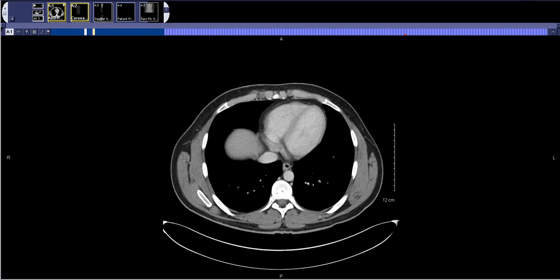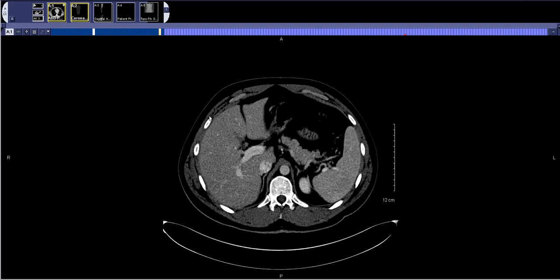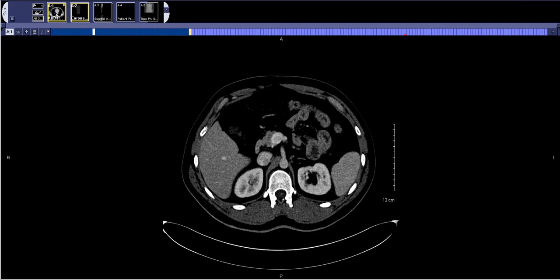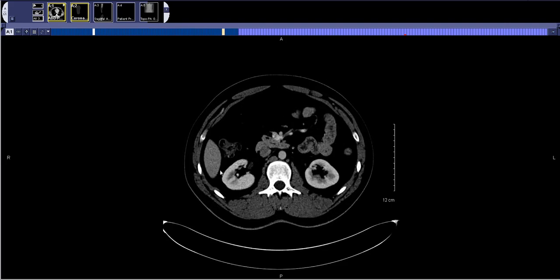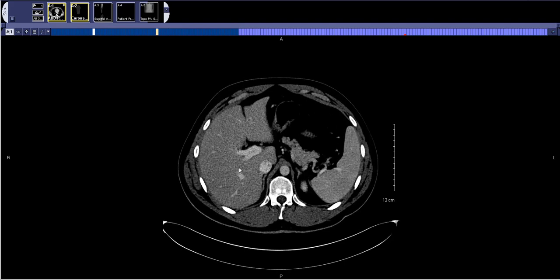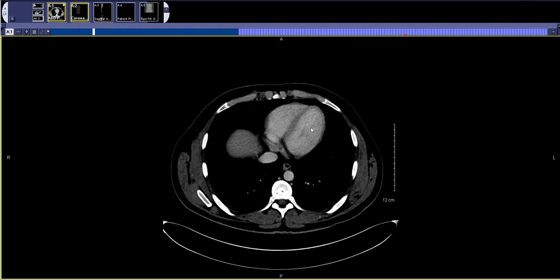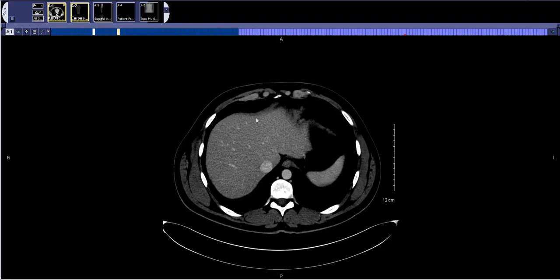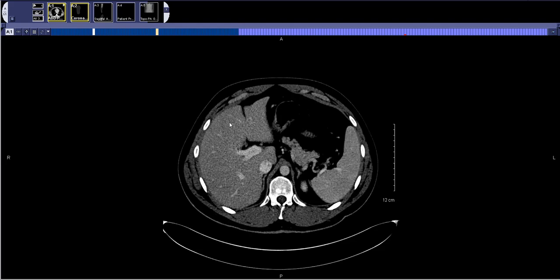At that point I switch to liver windows. I go through the right half of the liver, looking anteriorly, and then I go through the posterior right half of the liver, and then I go through the left half of the liver as I go down.